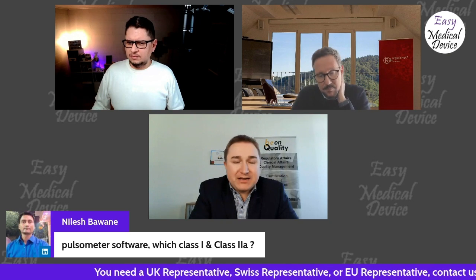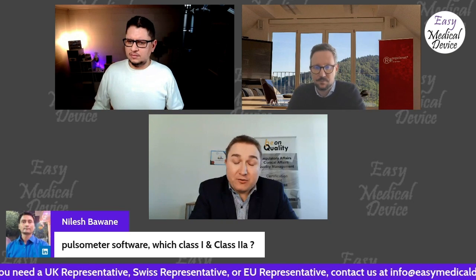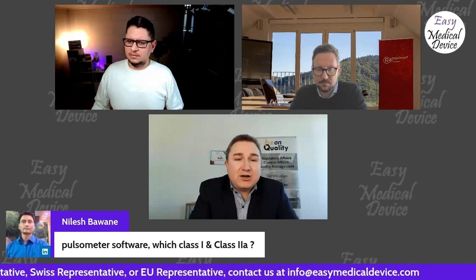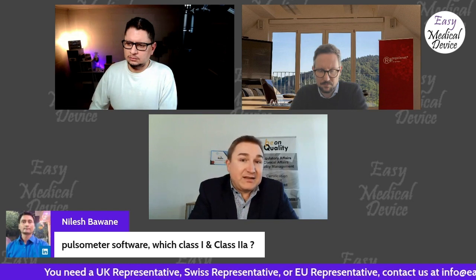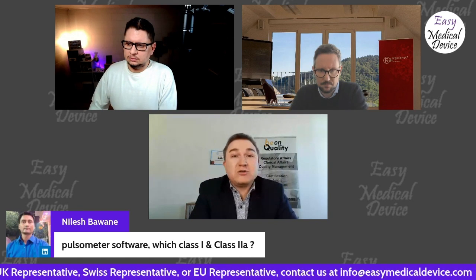Yeah. When the outcome of the pulsometer data is for myself to quantify and look from my perspective, for me with a heart failure, to look into my own decisions, my specifics, I could qualify it as non-medical device software, so as fitness. The other option is that this kind of data is available, however the data has no impact on anything, but it is medical data, which I tend not to do. And then if it is real pulsometer software, from which I can take decisions, pulse is a vital parameter. So you could also consider class 2B.